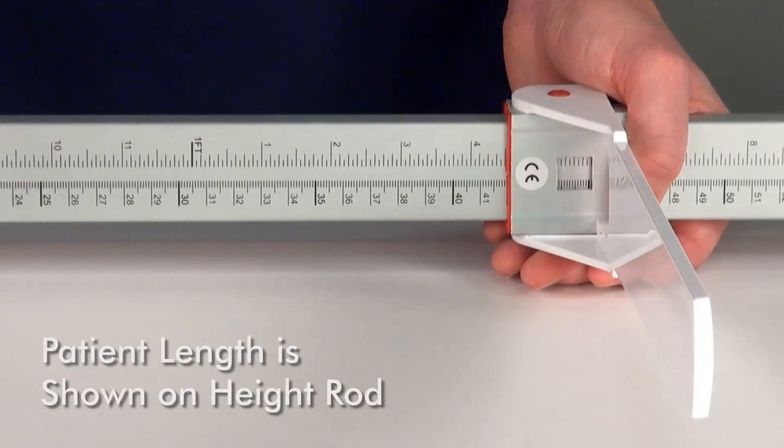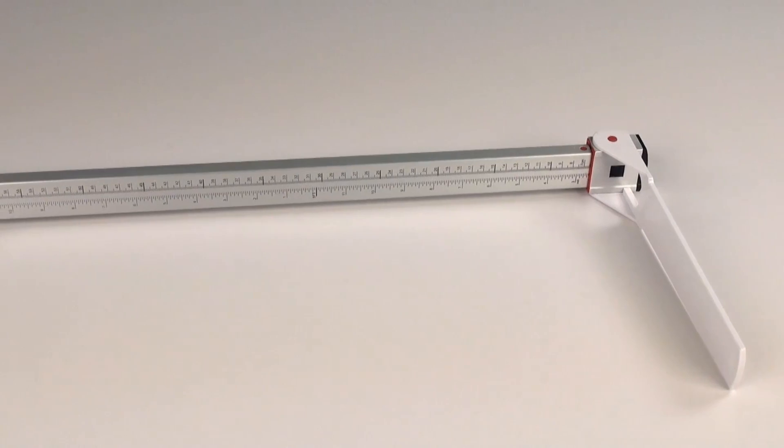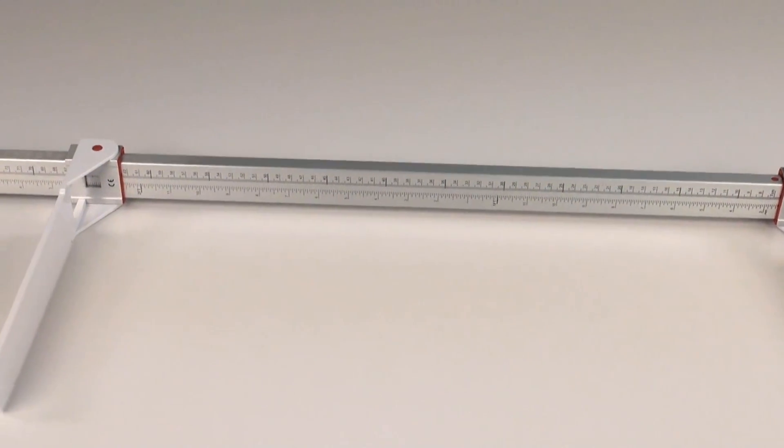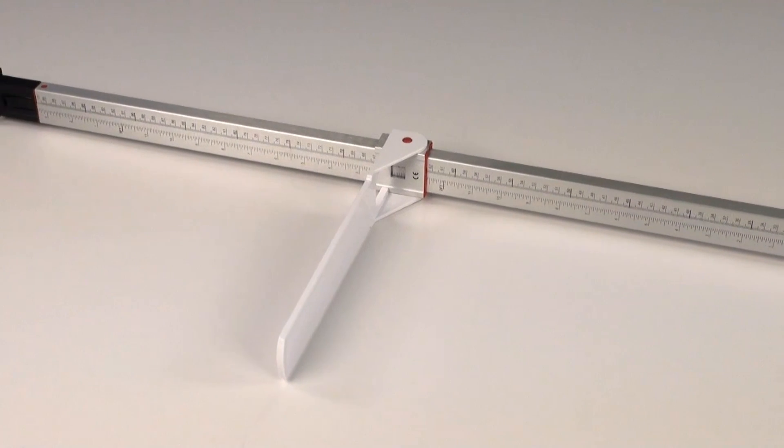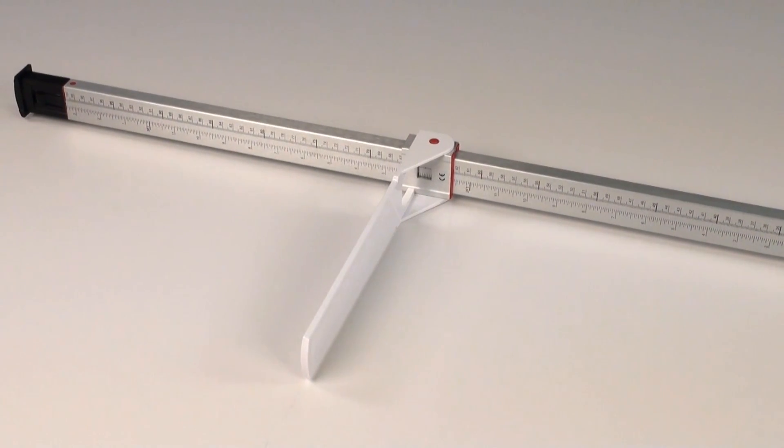The length of the patient will be shown on the height rod. The instrument's smart design also allows the measurement to be retained after usage, freeing the medical professional to attend to the patient first before recording the measurement.